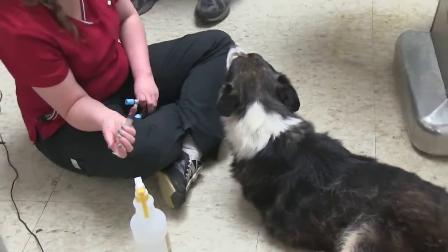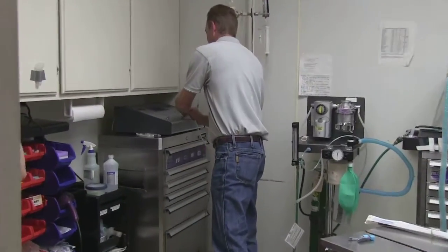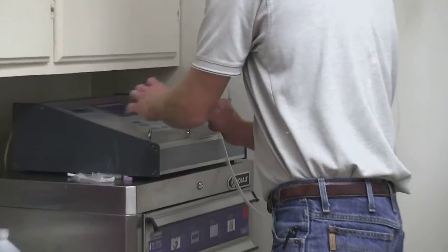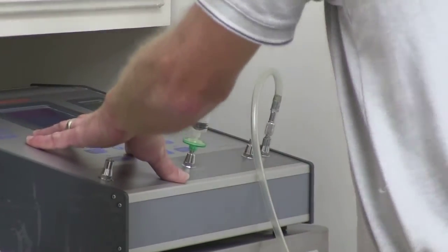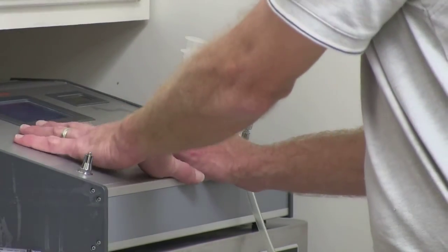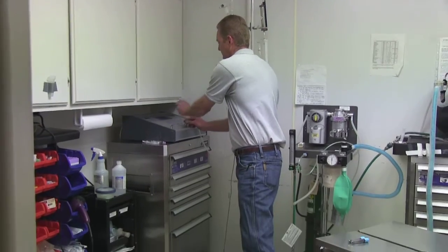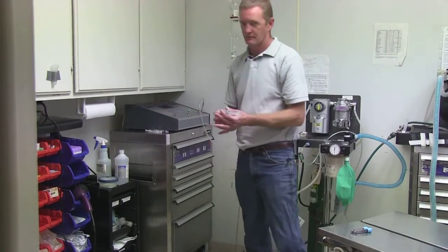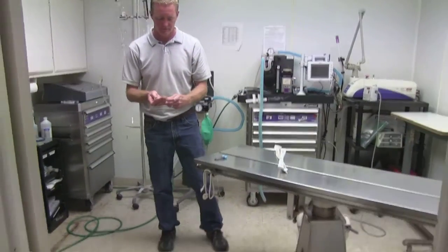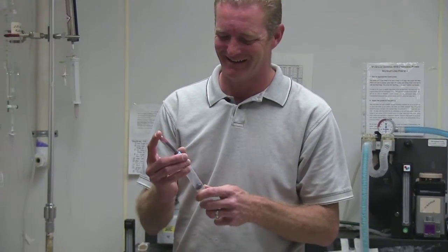We go to the patient and draw up the recommended amount of blood, then draw up ozone into a separate syringe. So we have ozone and we have blood. You then take the syringe containing the blood and ozone and go to the patient and re-infuse the blood. That's major auto-hemotherapy.